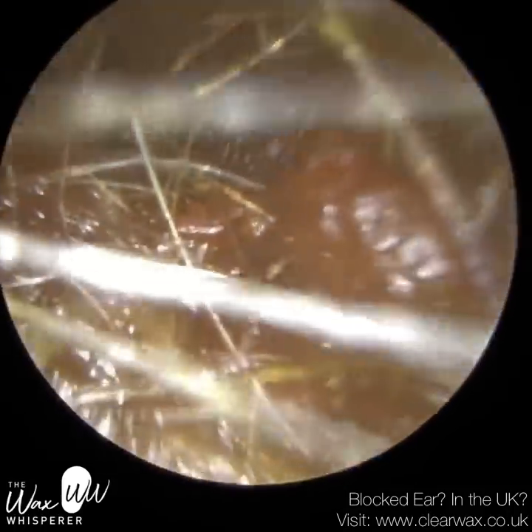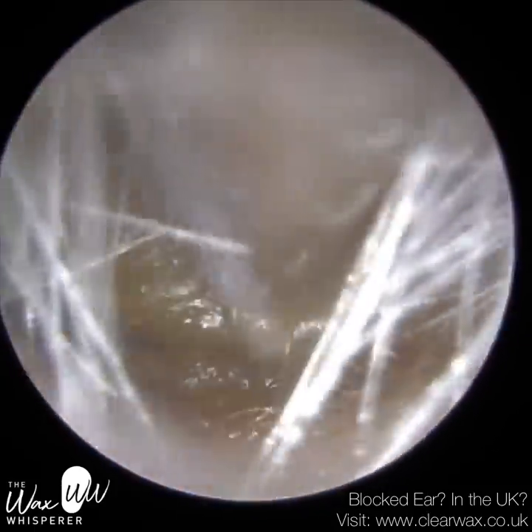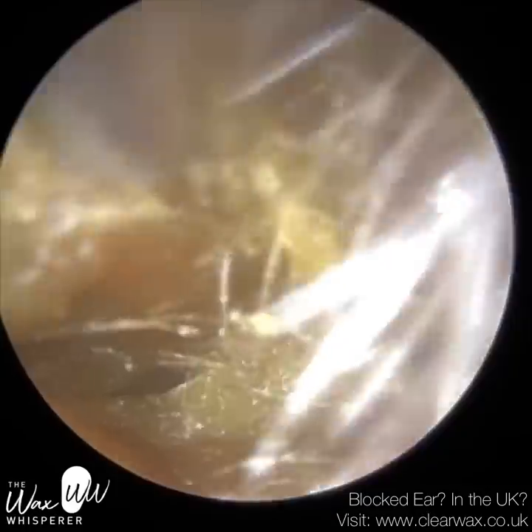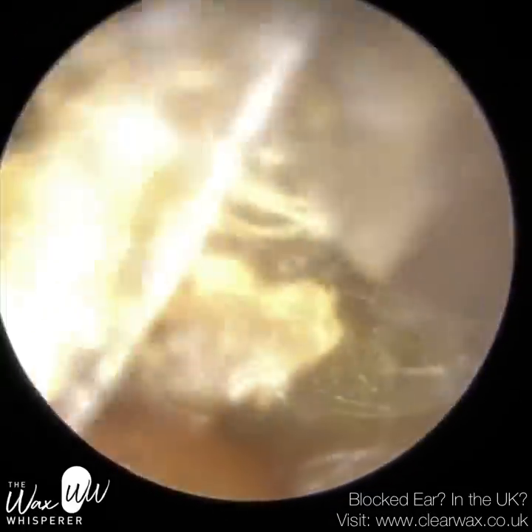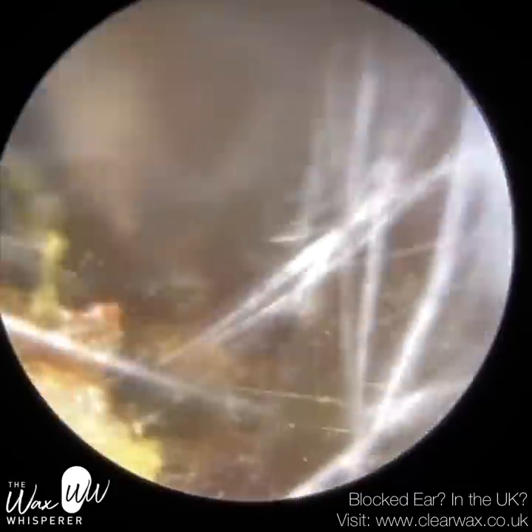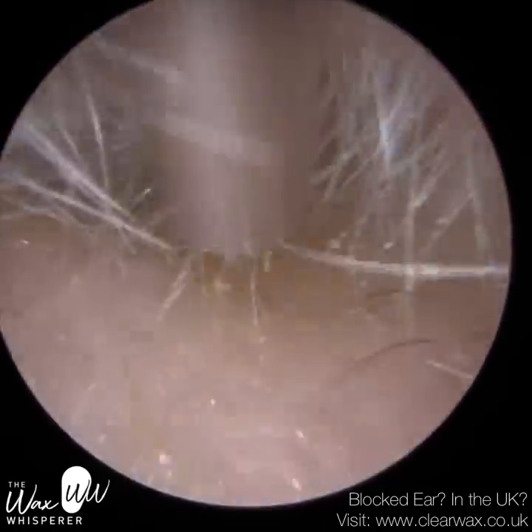We have here a patient who attended with bilateral, fully-occluding earwax and dead skin. In fact, they may have keratosis obturans in their right ear, which is far more complex than their left ear, so stay tuned for the right ear. In their left ear, you'll see the image in the thumbnail — we removed a large plug of dead skin. We know it's dead skin by the texture and the appearance of the surface of the plug. You can actually see the sheets of dead skin; there's a ripple appearance, a ribbed appearance, and that's dead skin.